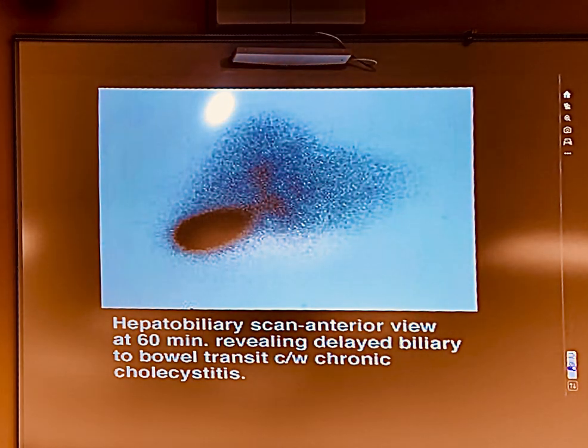So this is one of those times as a technologist when you go back and look at your doctor's report and it says that, and you call them up and say, can you just take a peek at this picture? Because I'm not so sure about that. And then they usually laugh and go, yeah, and then they change it. They do an addendum. So that is probably not accurate. At least I would say it is not accurate.